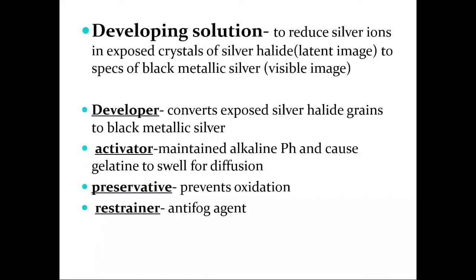You have a developer, activator, preservative and the restrainer, and the ingredients in the developer are phenidone and hydroquinone. Then in the activator you have sodium hydroxide and potassium hydroxide. Then the preservative is sodium sulfite and the restrainer is a bromine containing compound. So the function of each of the ingredients should be highlighted in this answer.